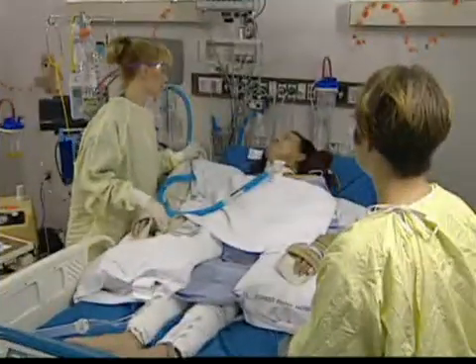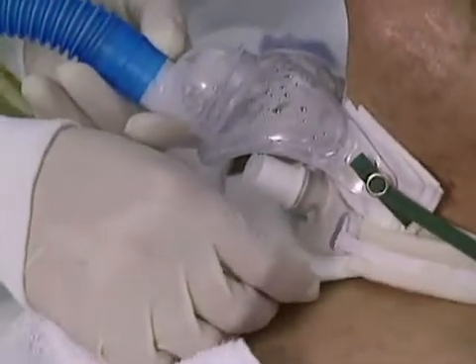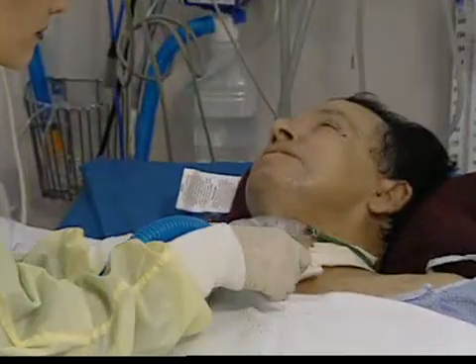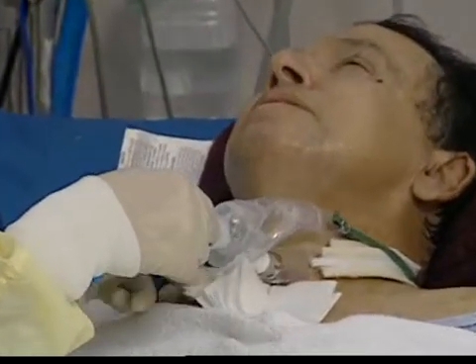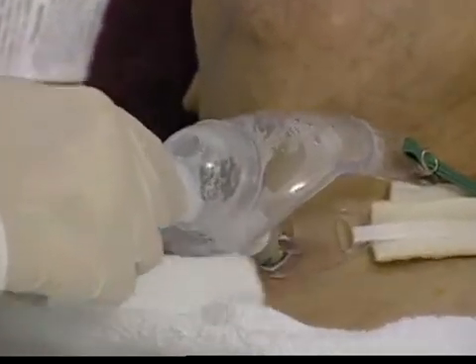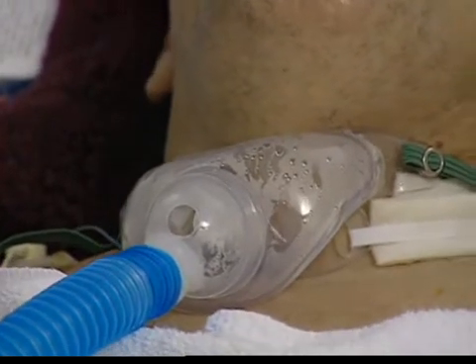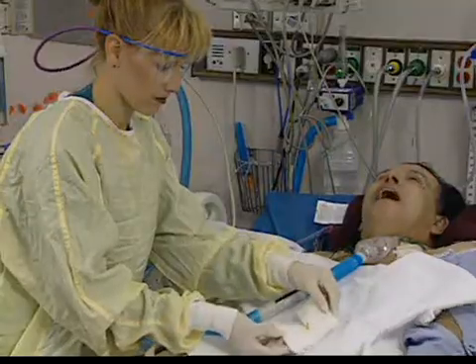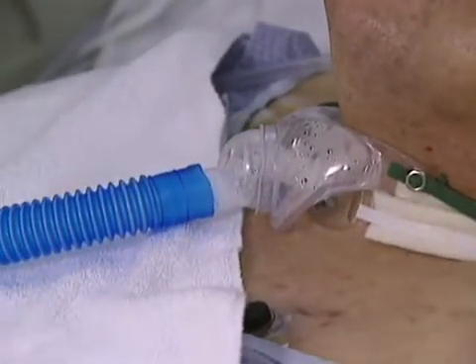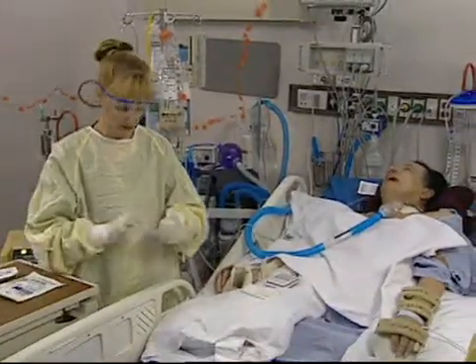Thank you, Mr. Gonzalez. I'm going to do your trach care now, okay? Tracheostomy care is performed at least every 8 to 12 hours, and more often as needed to remove airway secretions and drainage from the tracheostomy stoma. The tube itself may cause irritation at the insertion site. This poses the risk of complications, such as granulation tissue on nearby structures, tracheal stenosis, and erosion of the innominate artery or fistula formation. In planning tracheostomy care, consider the following questions.